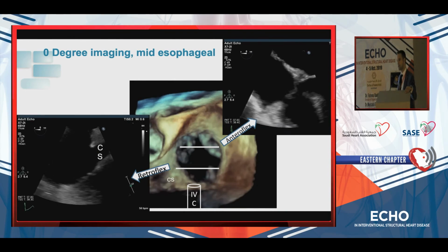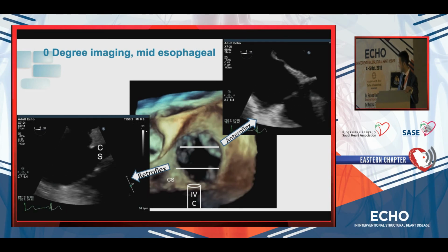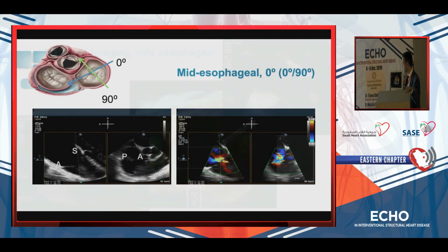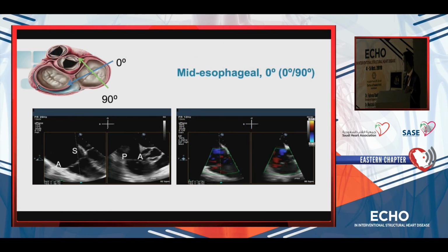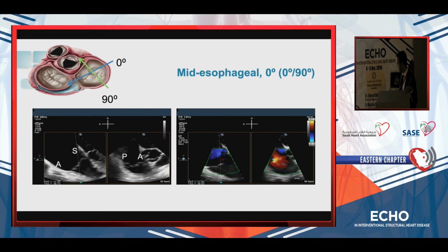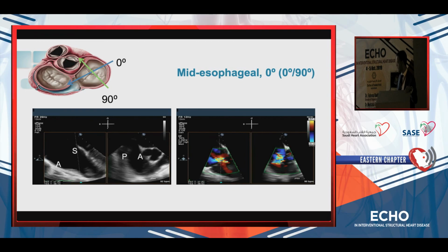What you can also do is have a 4-chamber view and use anteflex and retroflex to show the commissures between anterior and septal. And if you do retroflex, again, the coronary sinus comes in. Frequently you have the anterior and the posterior leaflets being shown here. And also use a lot of biplane views. So put in the cut plane, so you make a perpendicular view to your 0 degrees, and then you have a short axis at the base, going a little bit higher, with the anterior and posterior commissure. So at least more or less you know which leaflets you are looking at.